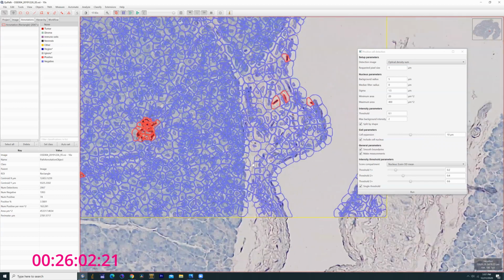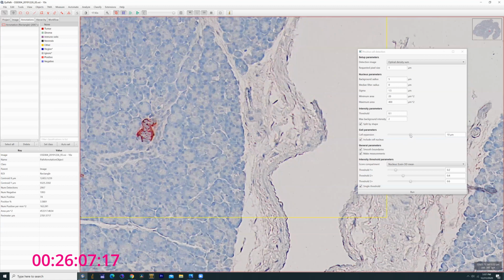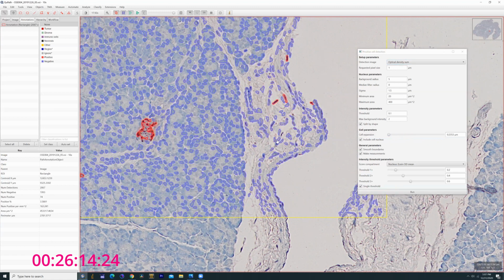Actually, by and large here, we go back to D, come back. I'm going to go back down to 0 for a second. I just want to see what we got here. Run. I'm going to set this about 5. To be honest, it's a little difficult to interpret with this tissue where I actually don't believe we have clean cell membranes, but the nuclei itself I actually trust based on the initial image. Most of it, not all of it, but most of it.